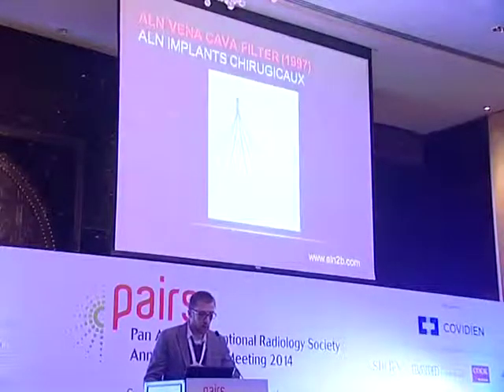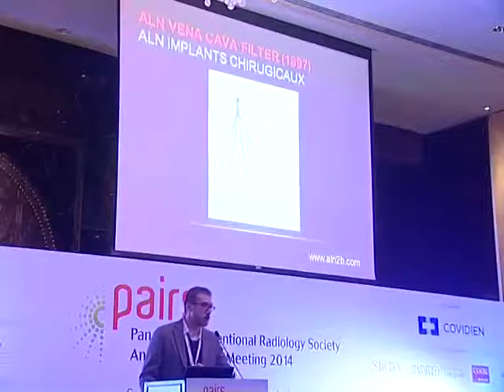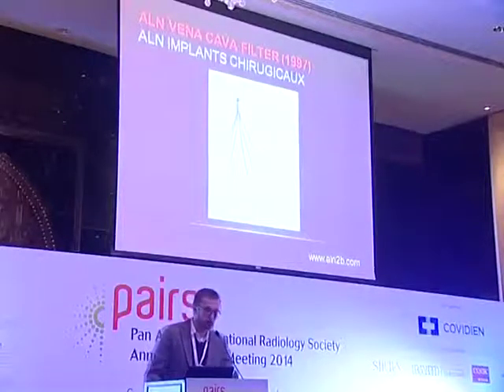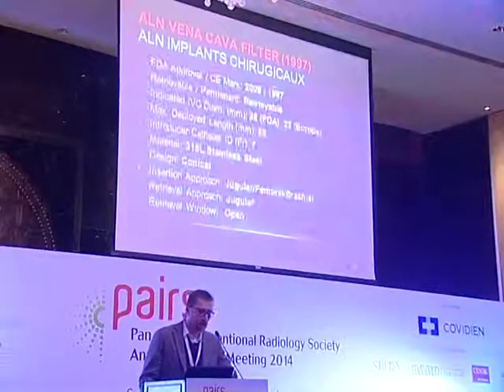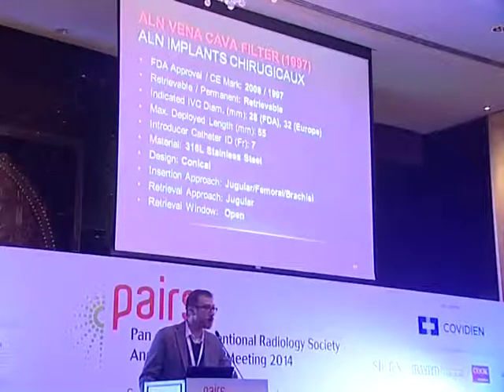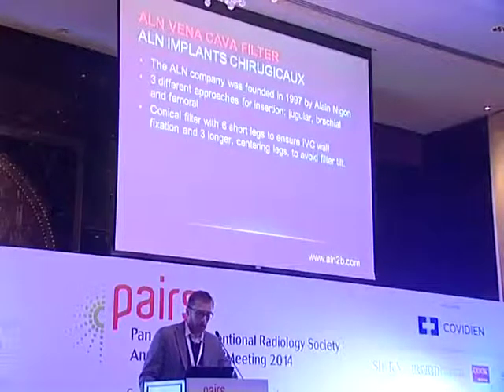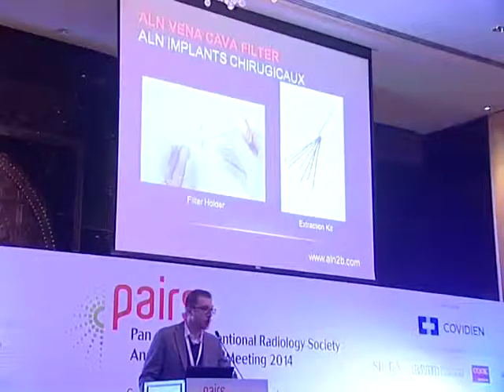ALN, the ALN filter is also a good filter. I managed to do the first clinical experience of the filter in Canada when it was approved in 2007. So it's been around the market in Europe since 1997. It was FDA approved in 2008 and approved in Canada in 2007. It's stainless steel again, and it can be inserted from jugular, femoral, or brachial. It is a conical filter. It usually comes in a filter holder, and the retrieval extraction kit, as you can see, is cone type.